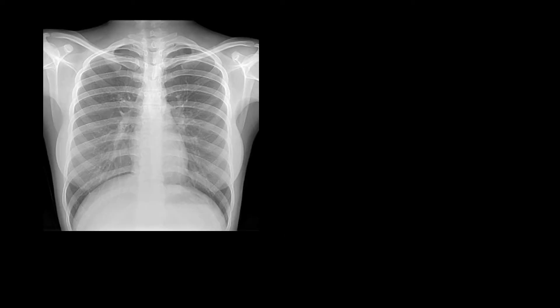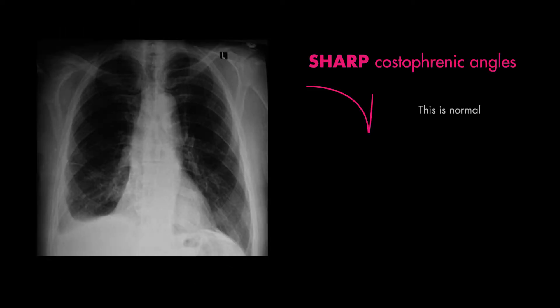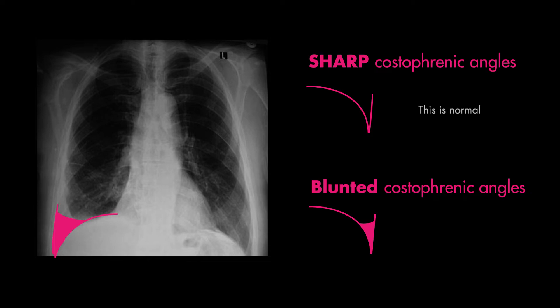In addition to making note of the curved shape of the diaphragms, make sure to follow them from edge to edge — that means from the pleura all the way to when it meets the cardiac silhouette. At the pleural edge, the diaphragms meet to make the costophrenic angles. This space should be sharp. Blunting of these costophrenic angles, like you see here, can imply many things, one of which is an effusion.